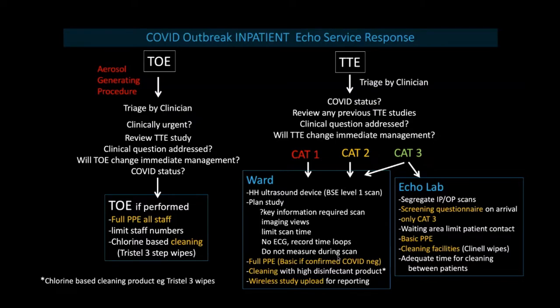And then the other key setting, other than the PPE that's already been discussed, and we've already said that in this setting we'd use full PPE, the issues around cleaning, but also wireless upload. So we've set up all our machines to be able to upload all our images wirelessly so that we can quickly review and report rapidly so that it's useful to the clinicians.